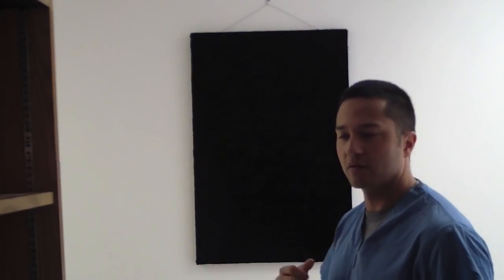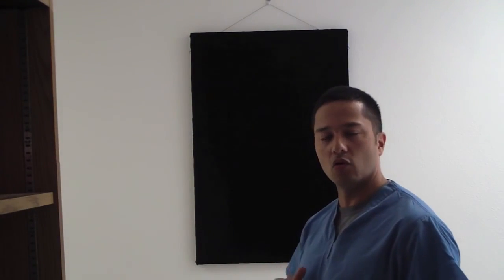I want to talk just briefly today about taking photos. I've been doing this for a couple of years now, daily, and I've learned a lot of tips from a whole bunch of folks, shared a lot of nice experience. So we're going to briefly walk through, say, the initial experience of taking photos with your patient.